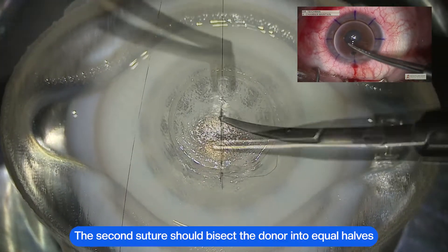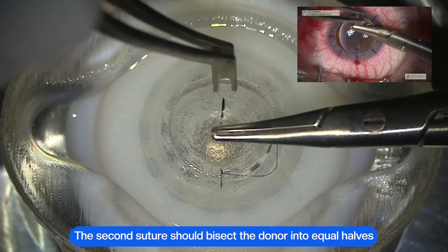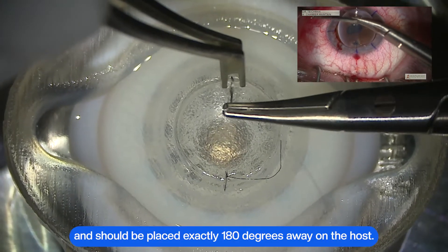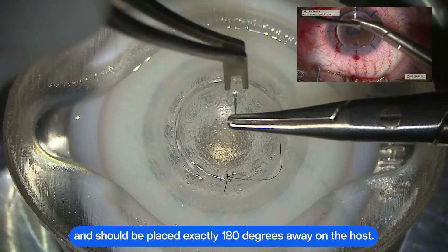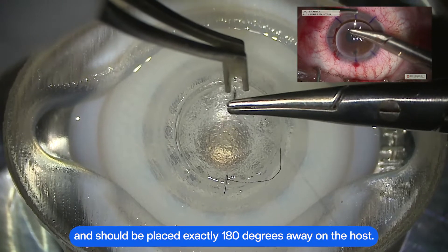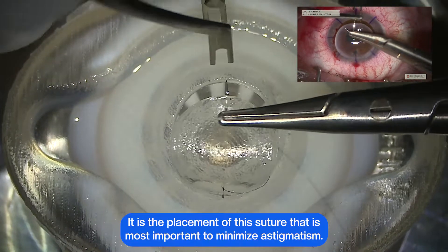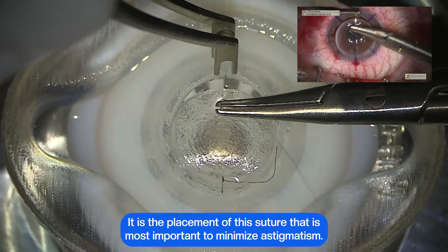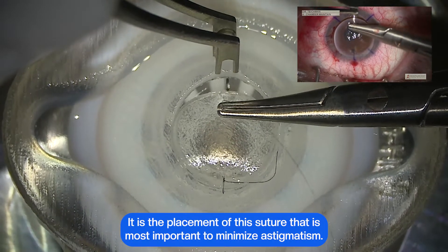The second suture should bisect the donor into equal halves and should be placed exactly 180 degrees away on the host. It is the placement of this suture that is most important to minimize astigmatism.